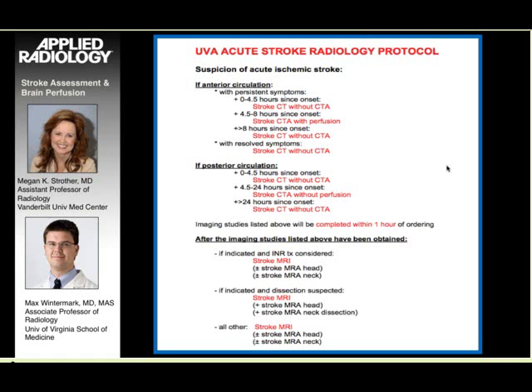We tend to use CT as our first line of imaging in all patients. In a similar way to you guys, we get just a non-contrast head CT in the patient admitted in the first 4.5 hours because, as you mentioned already in your talk, we want to get those patients to TPA as quickly as possible, so we don't want imaging in any way to delay treatment. Then in the 4.5 to 8 hour time window, we do exactly the same thing as you guys are doing.